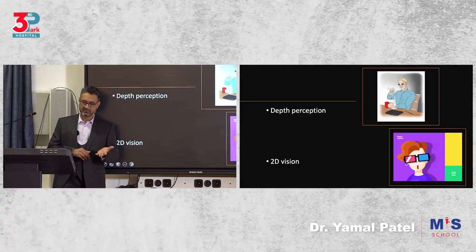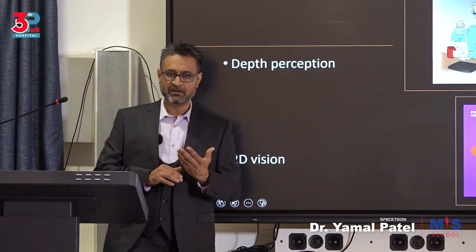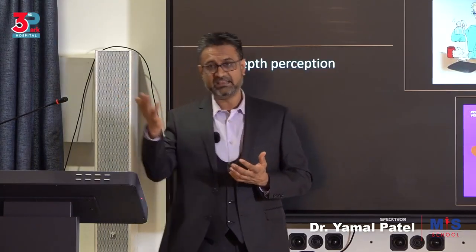You'll need to learn depth. You'll need to learn 2D, because most places, we have 3D laparoscopy in this place, but in most places you will be working with 2D laparoscopy.